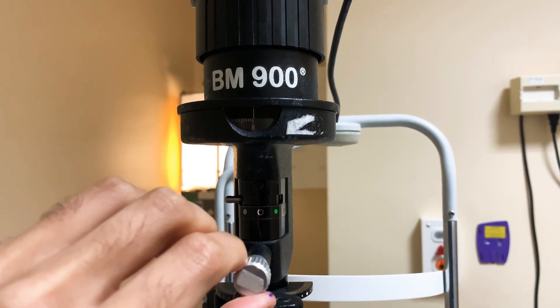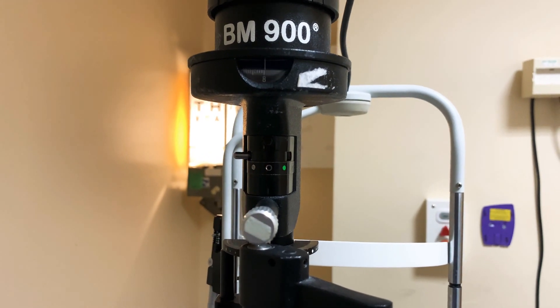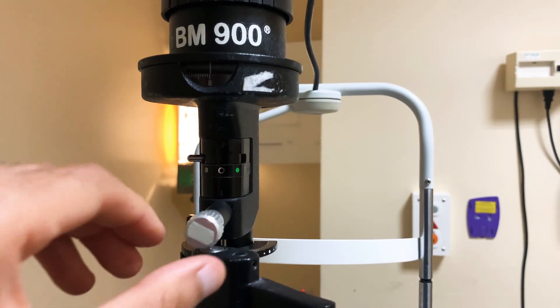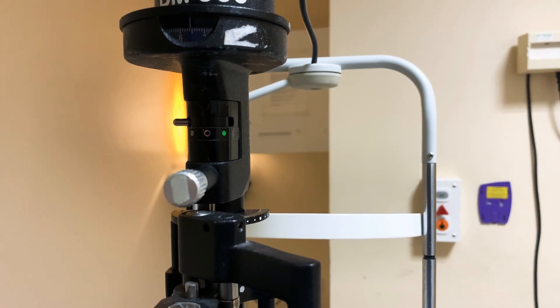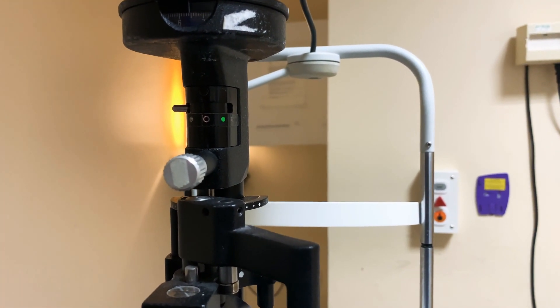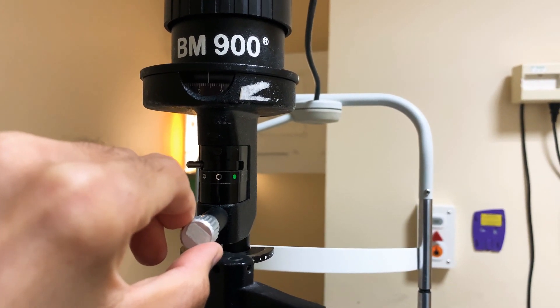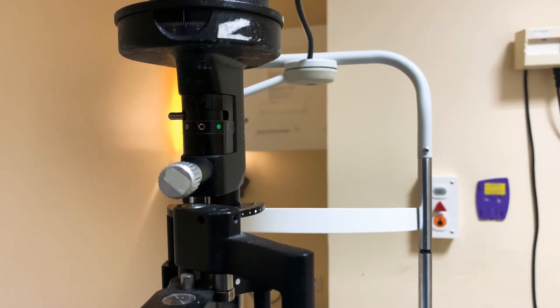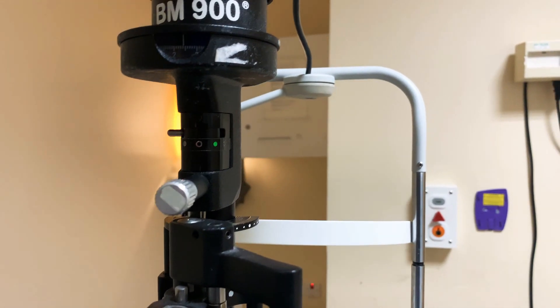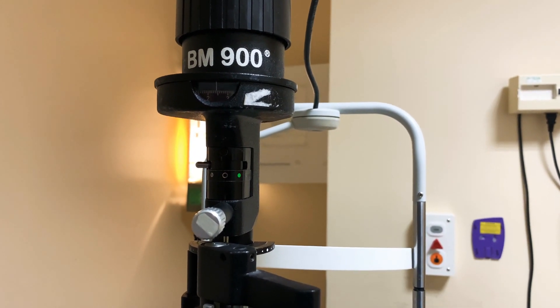You may wonder why you need to change the beam height. You probably don't, but if you want to, you can change it to match the height of a corneal abrasion or ulcer — for example, noting it's a 2.5 millimetre high corneal abrasion. That's useful for follow-up, to measure it again and see whether it's healing.